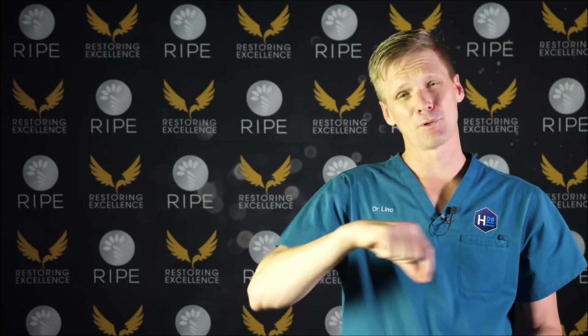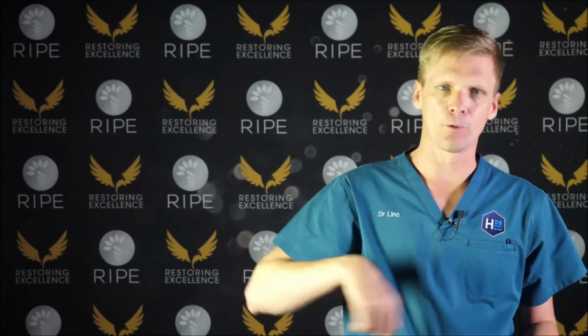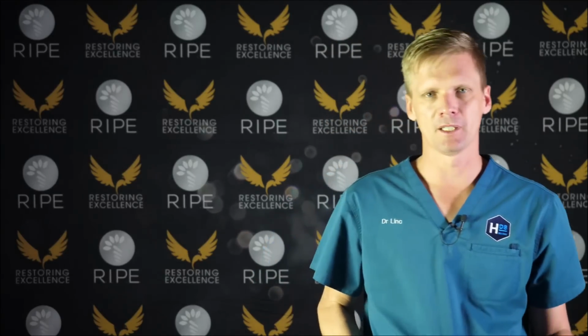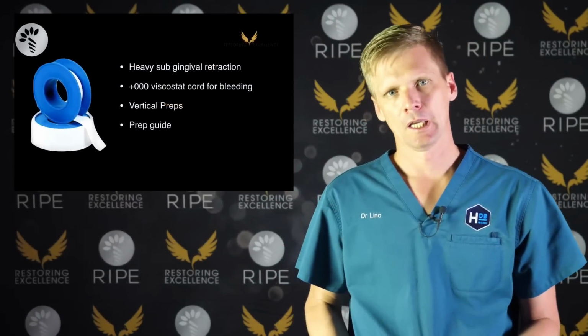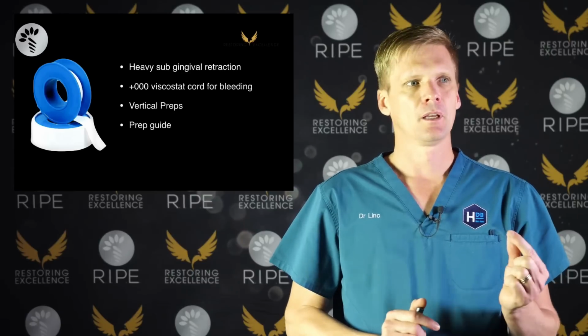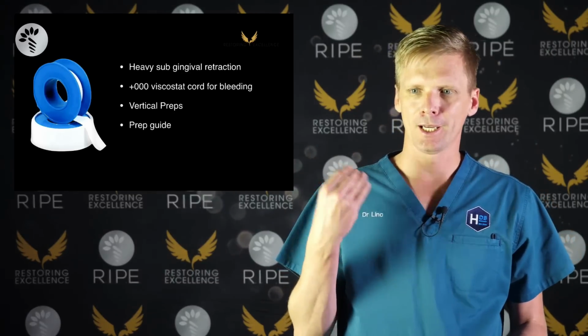So there are occasional times we'll actually get a really long piece of the thicker cord, the zero, and wrap it around the tooth twice. Now Teflon. Teflon is cheaper than the other two. It is much harder to use. So if you've watched cases where you've seen other people use Teflon, don't be fooled. It will take you longer to put in. Teflon can drive you mad.